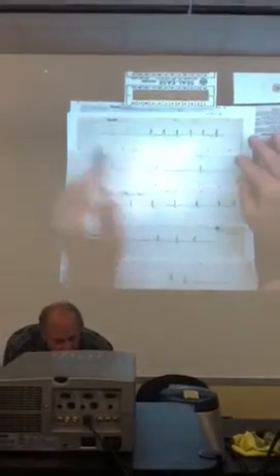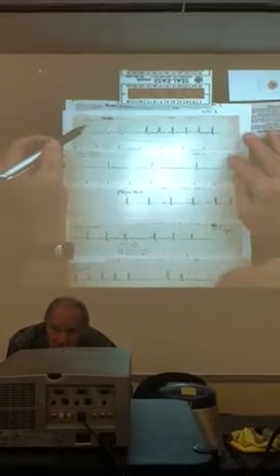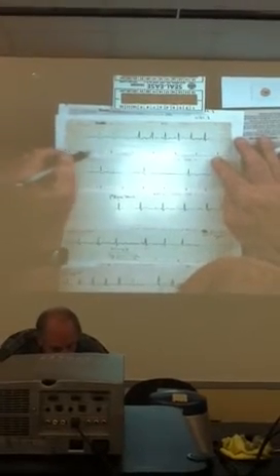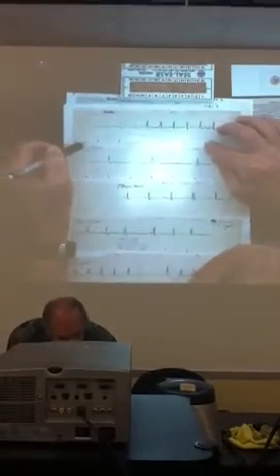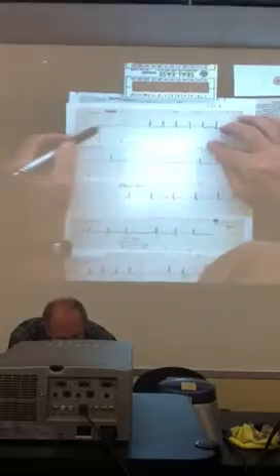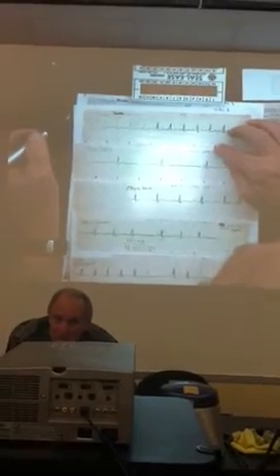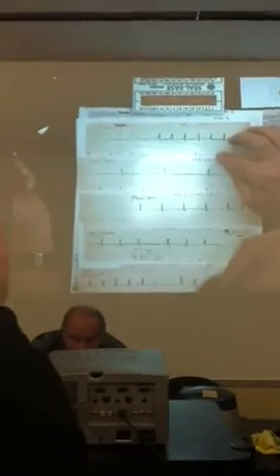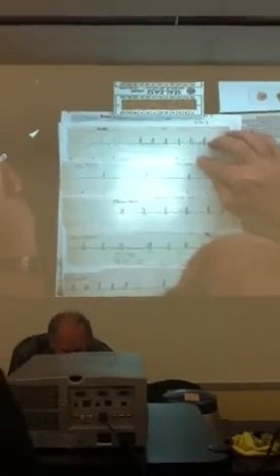All right, look at this one up here at the top. This is sinus rhythm. They used to say normal sinus rhythm. Now they just say sinus rhythm. Look at this guy's heart rate. 1, 2, 3, 4, 5, 6. So what we would do, count this one. 1, 2, 3, 4, 5, 6, 7, 8, 9 times 10 is 90. Now remember, 90 is still considered in the normal range. Once it gets above 100, you start getting into tachycardia, a fast heart rate. But that one right there would be 90.